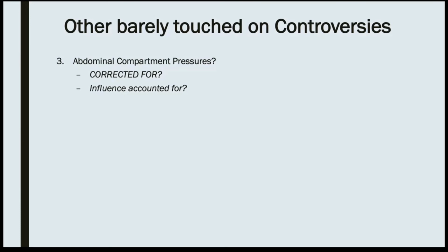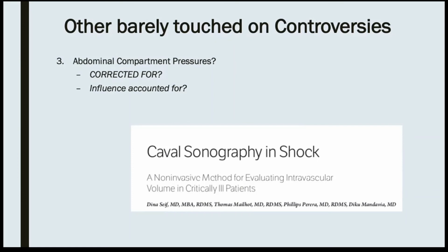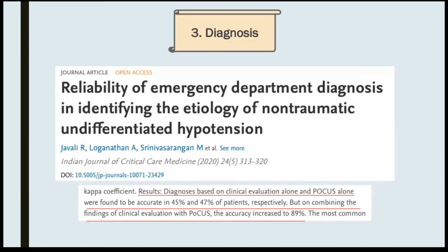Our ill patients, with spontaneous bacterial peritonitis, obstructions, just belly problems, have something called intra-abdominal hypertension. What if that pressure is transmitted to the IVC, and now we're measuring something that has external pressure from the disease process? And none of the studies actually correlated this with whether the patient has intra-abdominal hypertension. So there's another controversy, and it's a really difficult thing to get right.